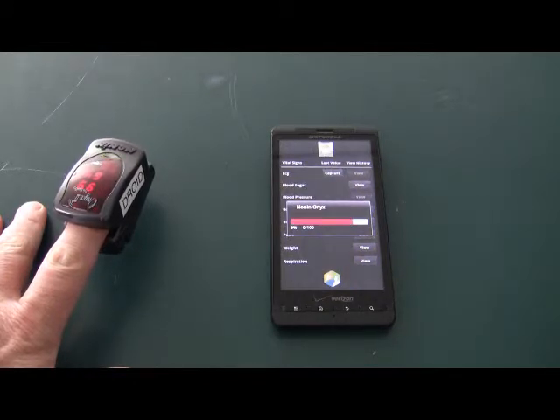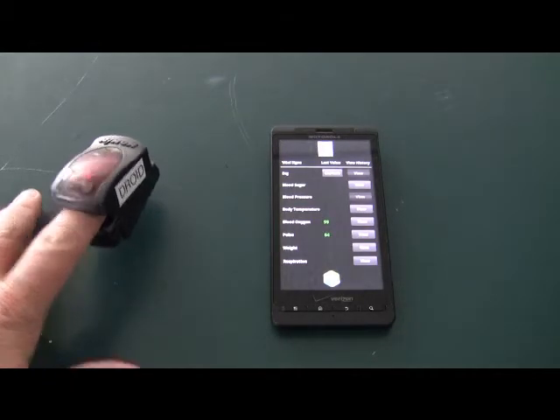Measurement acquired. Measurement stored. It's as simple as that.